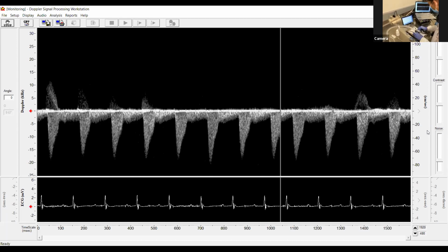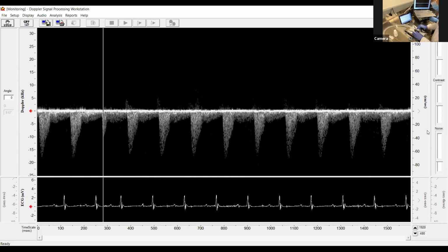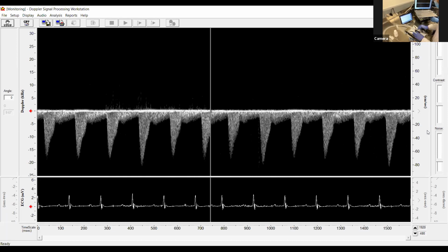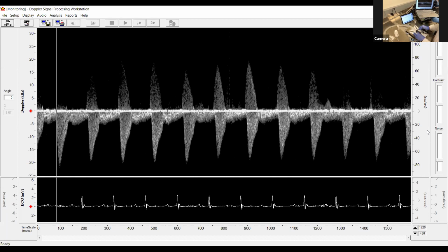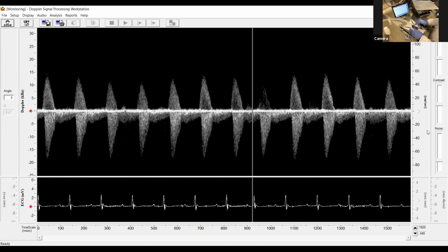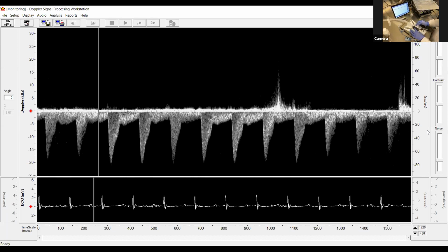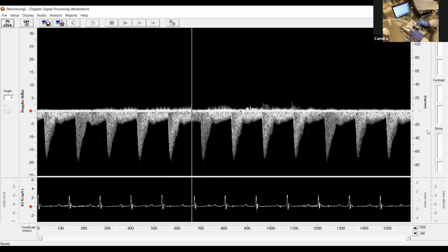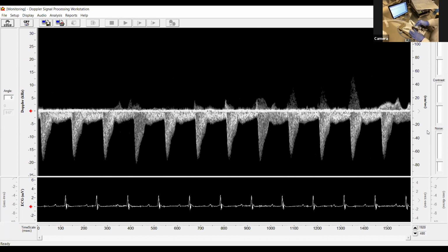Channel B to how deep? Deeper or lower? Very good. Okay, so you can start to see the signal coming from Sydney's second probe in the upper direction.